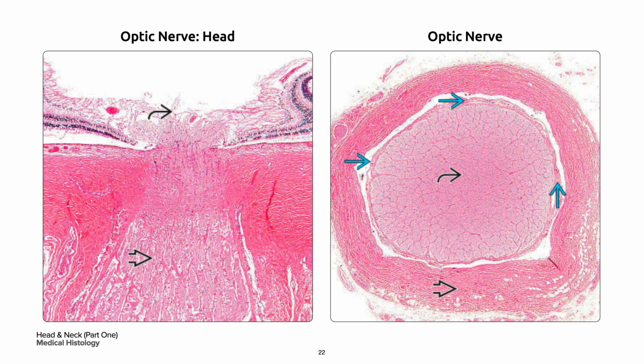On your right, a cross-section of the optic nerve shows the nerve in curved black arrow centrally, surrounded by a thin pia mater, the arachnoid in a blue single arrow, and the much thicker dura mater in bold black arrow.